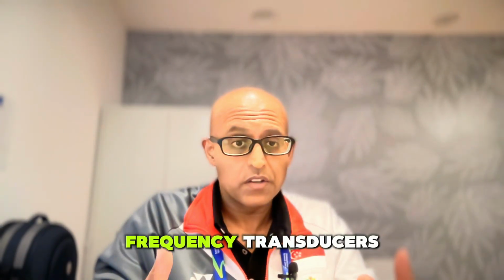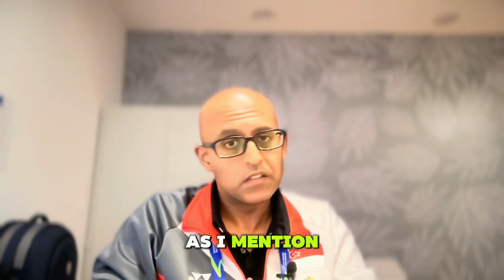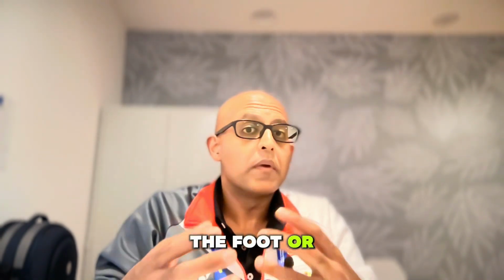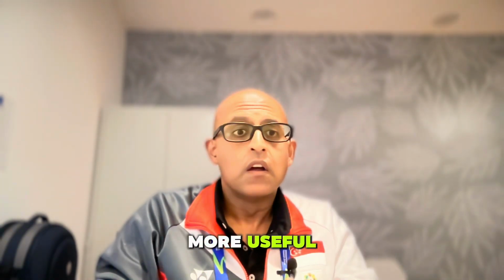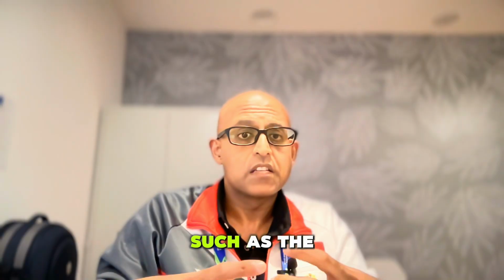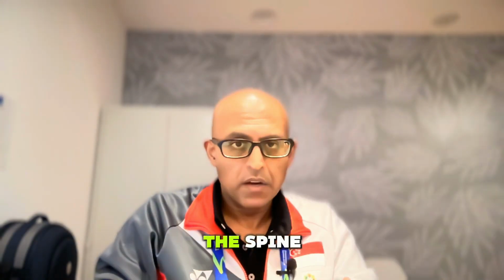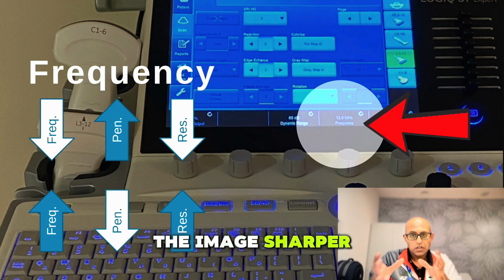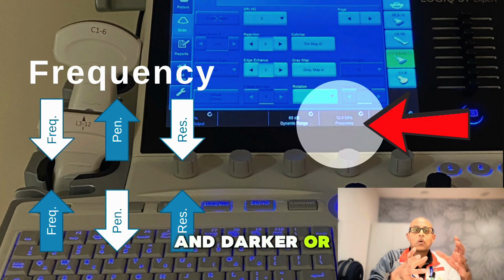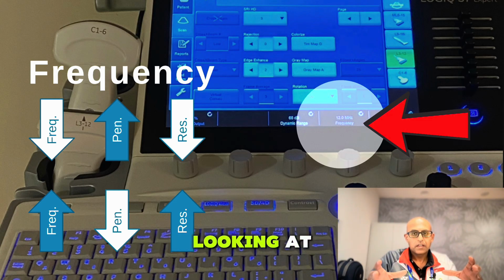So the high frequency transducers are really useful for superficial structures, as I mentioned, the hand or the foot, or maybe even the ankle. The low frequency transducers are much more useful for deeper structures such as the hip, maybe the shoulder joint, or even the spine. By adjusting the frequency, you can make the image sharper and darker, or brighter but less clear. Depending on the depth of the structure that you're looking at, you may need to go either way.